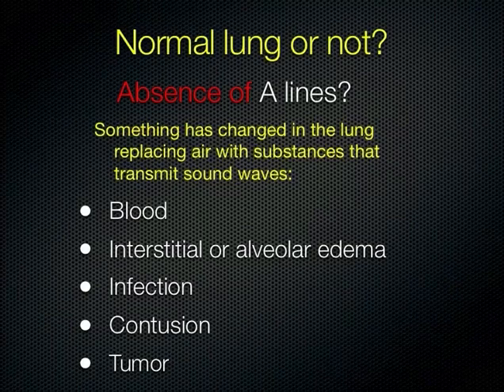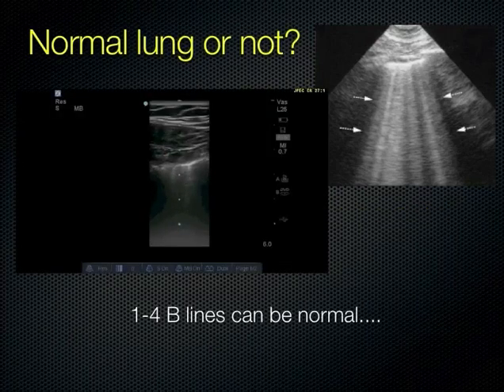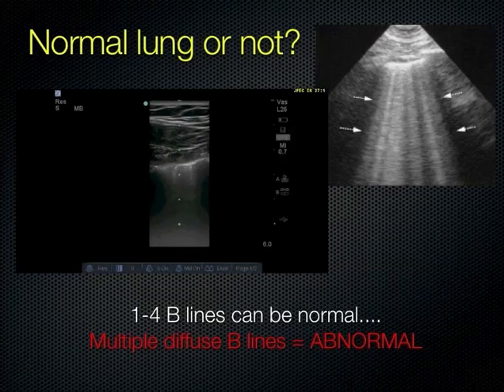B-lines are vertical artifacts that erase the A-lines. A normal aerated lung has A-lines, but if you have B-lines, these are artifacts created by fluid in the lung that will obliterate the A-lines. Normally you can have a couple of small ones — up to three or four — that can be normal. But if you have multiple diffuse B-lines in multiple fields, that is abnormal: fluid has overtaken the air in the lung. That fluid next to the air creates a reverberation that is vertical.